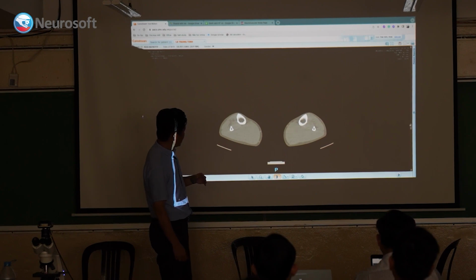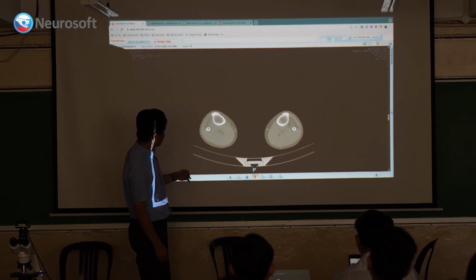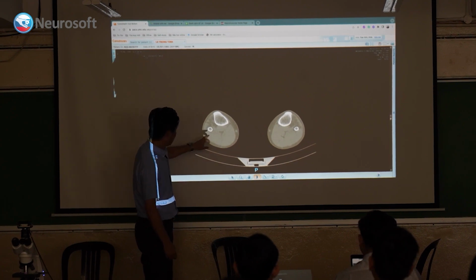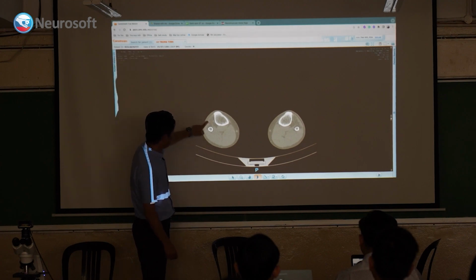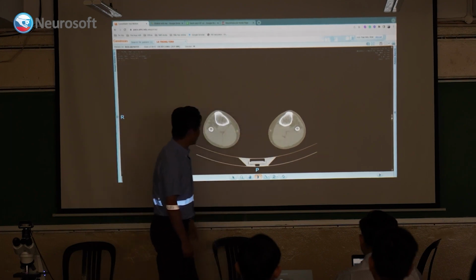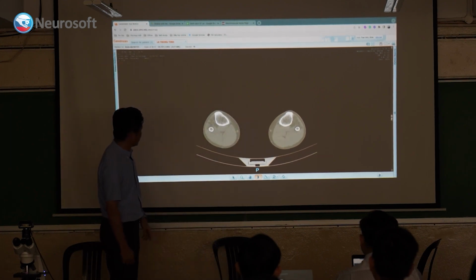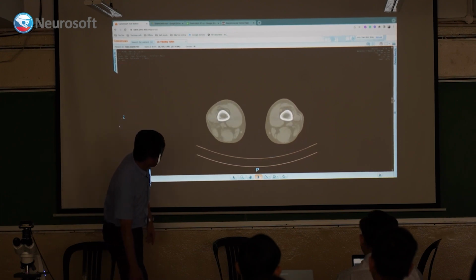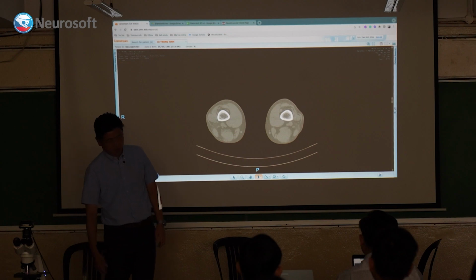Go up. Yeah, stop. Yeah, TA is affected, but I forgot this one, tibialis posterior or something else is also affected here. So I think the pattern is different. Yeah, and really at the proximal portion.